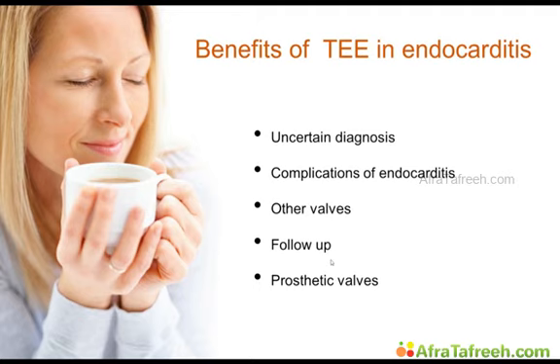To follow up patients, if you would say we'll go conservatively, it's nice to have a TEE study as a baseline to follow her up. It's better than following her up with a transthoracic echo. And then, especially in prosthetic valves, because in prosthetic valves, transthoracic echocardiography is inferior to TEE, no question. So this is the reason we performed a TEE in this patient.